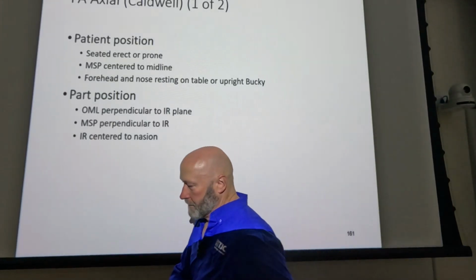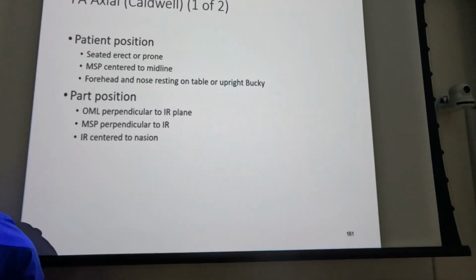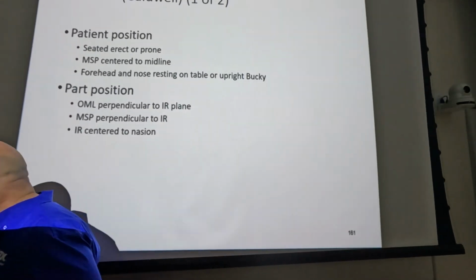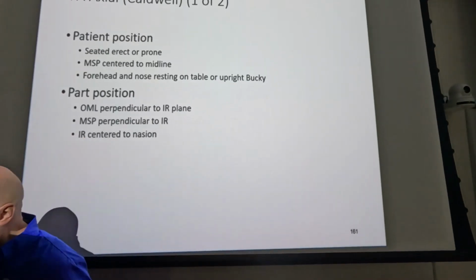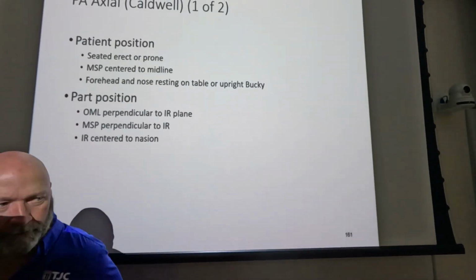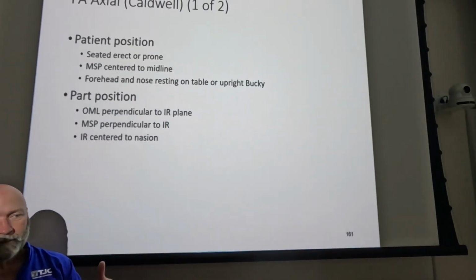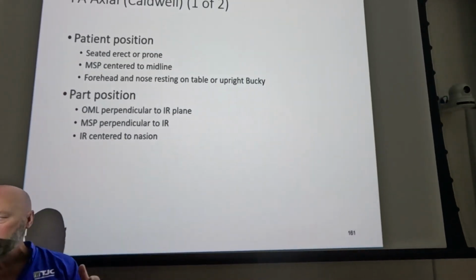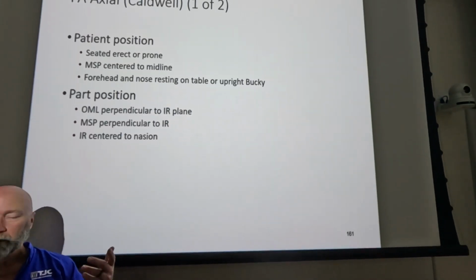All right. So what if you have to shoot AP? If you have no other option, then you have to shoot AP. I'm getting this out here so I don't crack my head open. So your patient's lying down on the table, right? And you've got to accomplish all the same positioning angles that you would have to for PA.